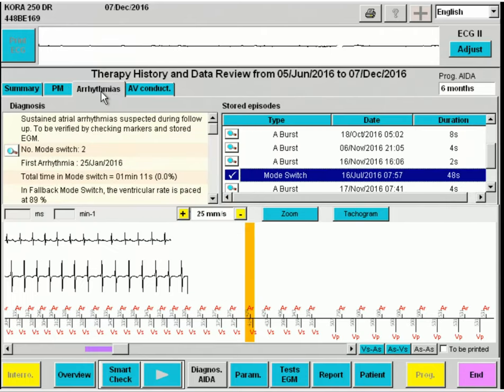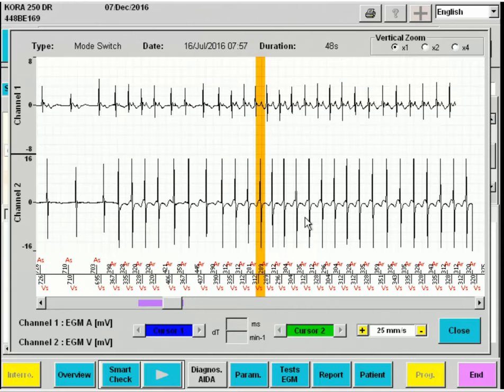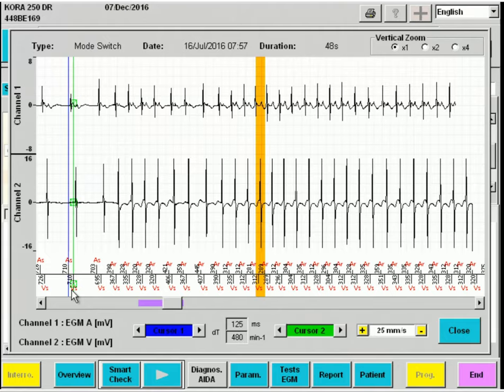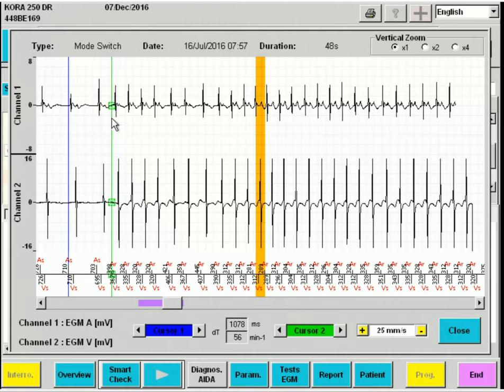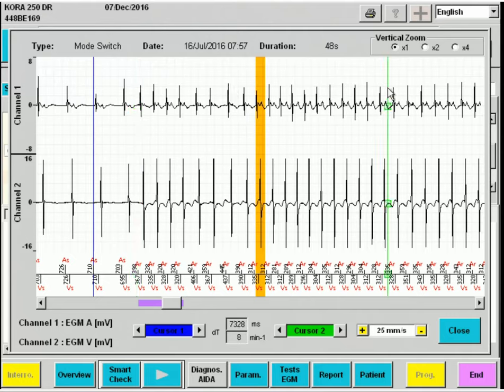We proceed to arrhythmias, where we can see a mode switch which occurred when the patient had an atrial arrhythmia. Here we clearly see atrial-ventricular association with only AS-VS complexes. The atrial arrhythmia starts here, and we can see that the AV conduction remains intact for all cycles.